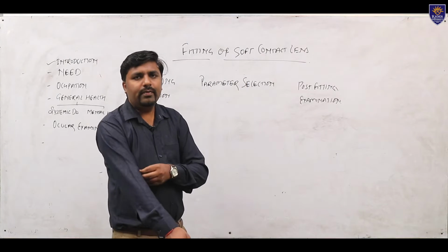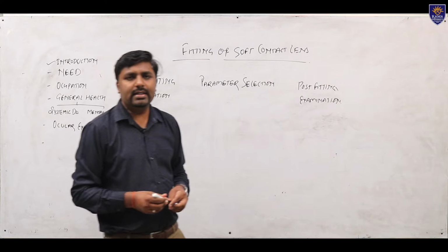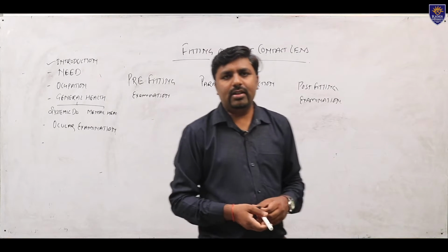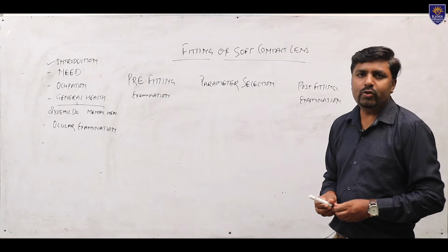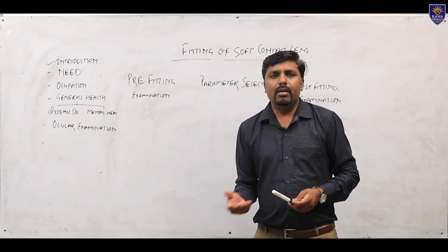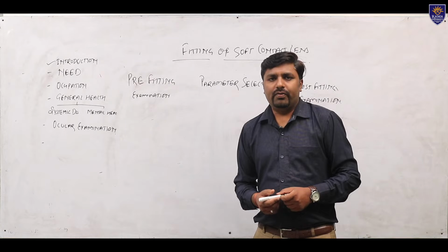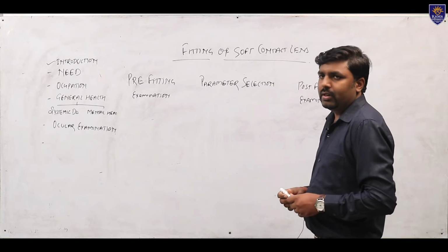Today we will discuss the topic of fitting of soft contact lenses. As you know, the contact lens is an optical device which is used to correct refractive error and used for therapeutic purposes, cosmetic purposes and many more. So, we should know how to fit and what the requirements are to fit contact lenses.